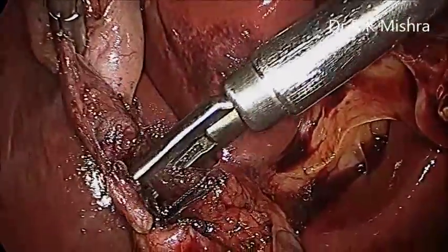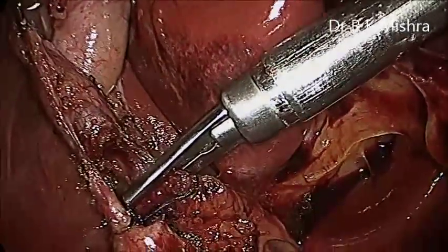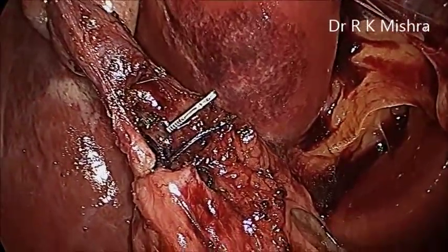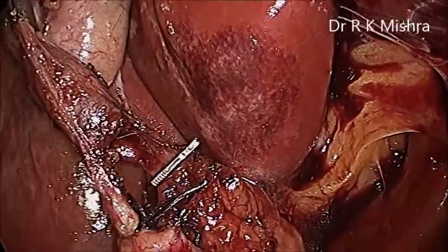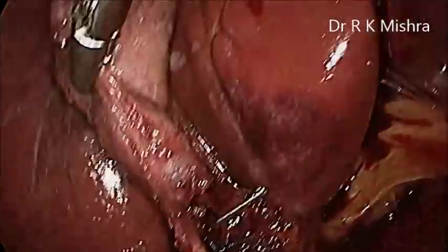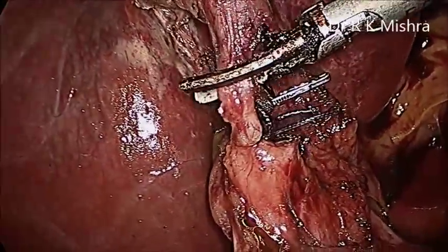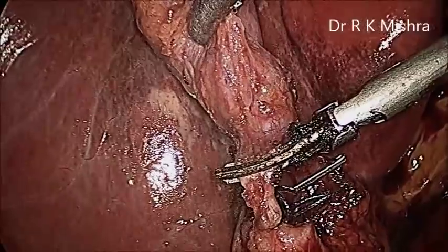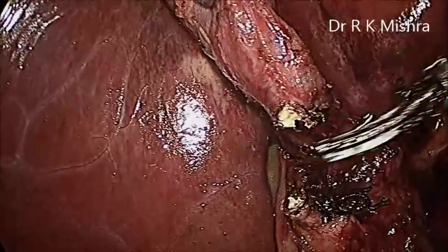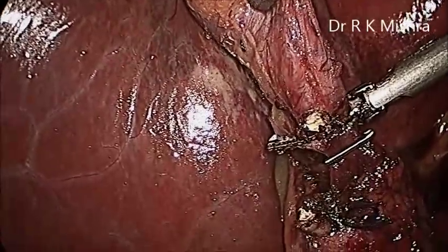Before that, this is the cystic artery which has been clipped. Only one titanium clip we have applied here. Although according to the book, if you apply three, it is good. But because here we are using harmonic, it will reinforce the clip also. Now this is the duct. When you are cutting it, you should release any traction. Let it be loose so that the protein will coagulate and the elastin and collagen will seal together. And now this duct is cut and then the artery is also separated.